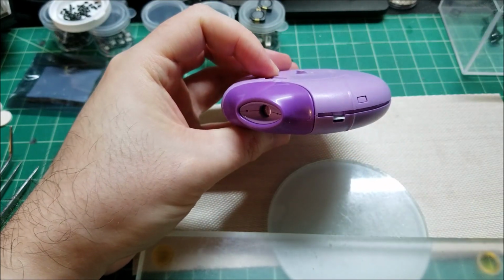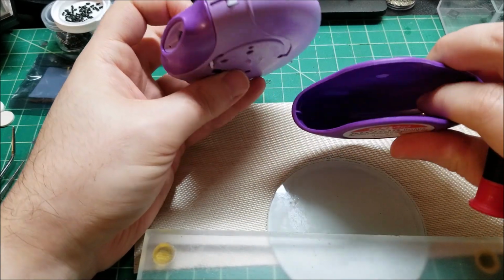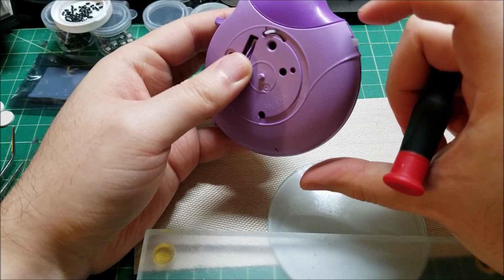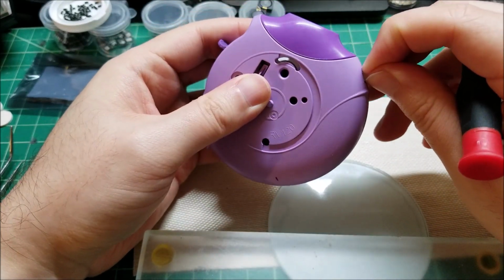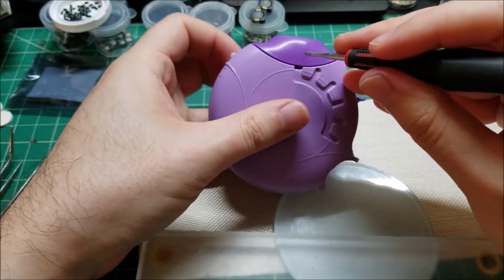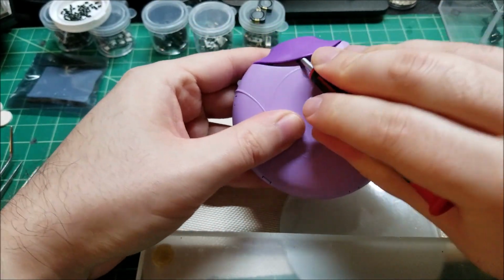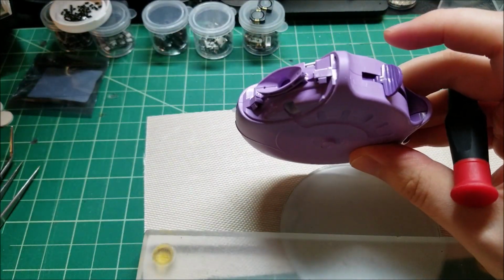I think it rides, yeah, within, there's a little groove in here, and that rides in there. And that, I guess, provides the stop, because the groove is only a certain arc length. So that provides a hard stop, so you can't keep rotating it. I guess the next step is to pull off this piece. There's a convenient little hole here. And we're just going to shoot that off there.